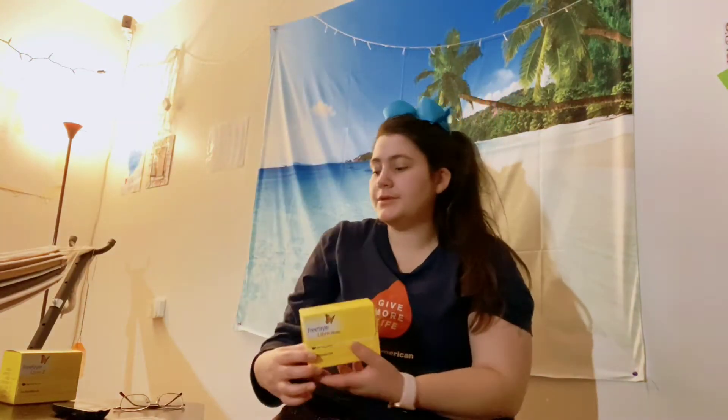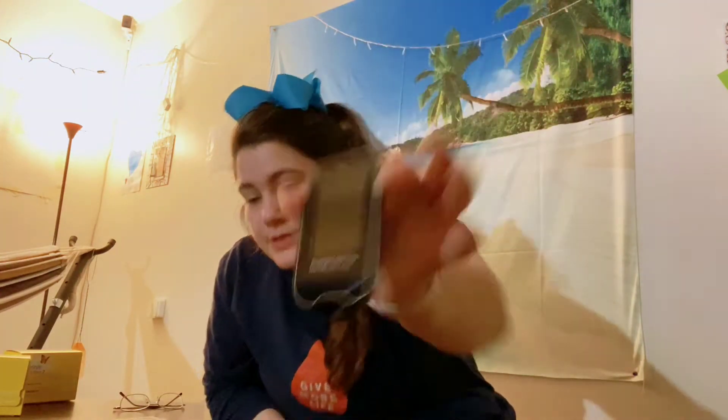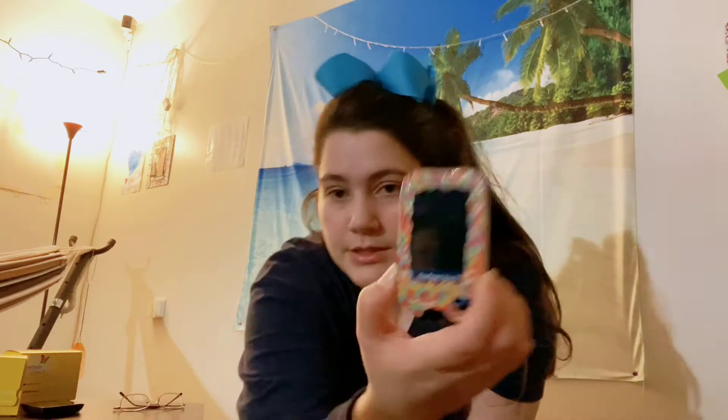So this is the 14-day. They do look completely identical, but the reader is different. The 14-day one is black and it also says '14-day' right on there, whereas the new one is blue and says 'Libre 2' on it.